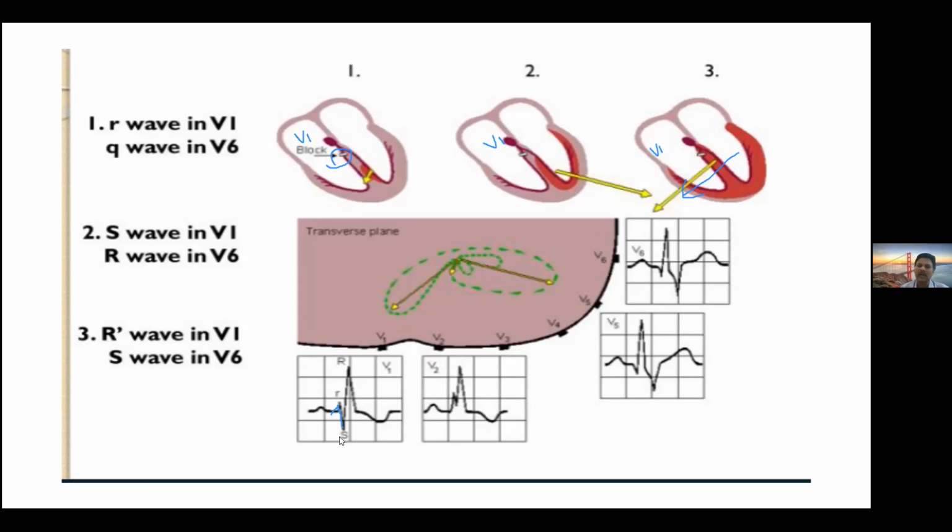So the next R wave will be taller. See here in the bottom, taller. Because the QRS is wide, as I told you last class, whenever there is going to be a wide QRS or the height of R is very tall, you will always have secondary repolarization abnormality. So ST segment and T wave inversion happens.